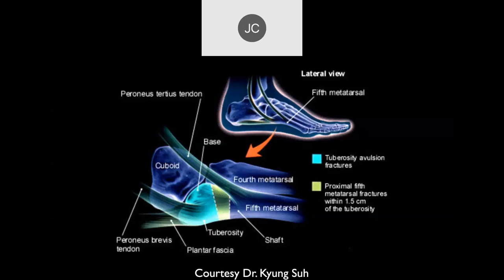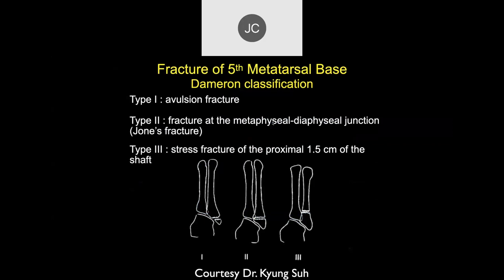The peroneus brevis tendon attaches here and the plantar fascia comes across here. There are typically three types of fractures defined at this location. One is an avulsion fracture, typically in plantar flexion, where you have avulsion primarily from the peroneus brevis tendon attachment, which pulls off the bone — usually just the distal tip, the tuberosity. Then there's a type two, which is a fracture at the metaphyseal-diaphyseal junction, commonly called a Jones fracture. However, the nomenclature is not uniformly used in clinical practice.